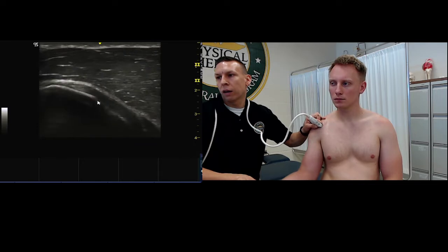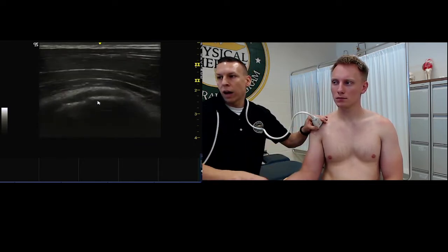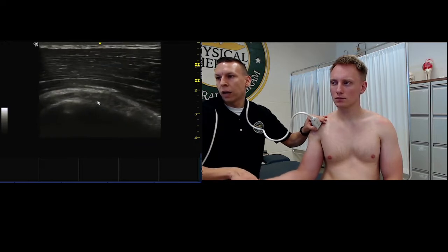After you've looked at it here in long axis, you're going to want to turn your probe again 90 degrees so we can look at it in short axis.